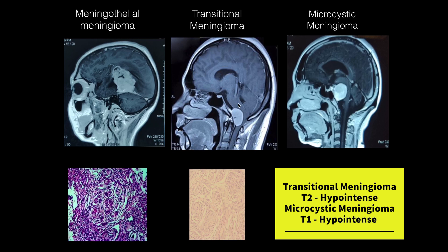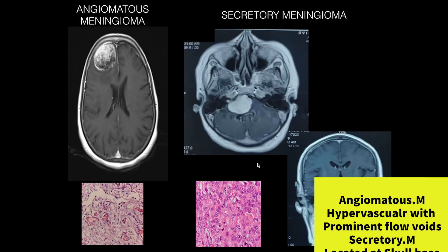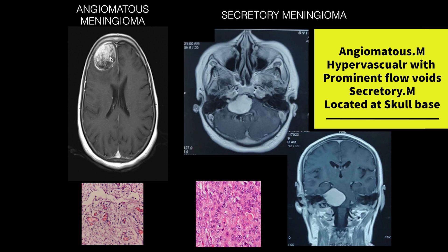A clival meningioma causing compression of the adjacent brain stem turned out to be the microcystic variant, characterized by T1 hypointense signal intensity, whereas the transitional type is characterized by T2 hypointense signal intensity. A right frontal convexity meningioma was the angiomatous type, characterized by increased vascularity. A right CP angle meningioma compressing the brain stem turned out to be the secretory type, which has a predilection for the skull base.